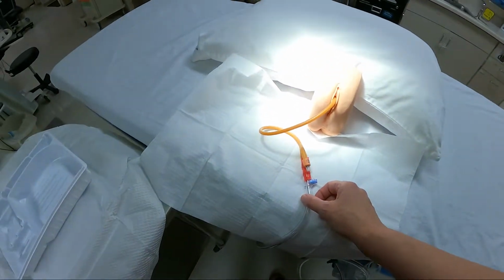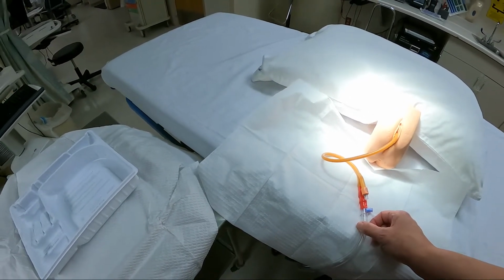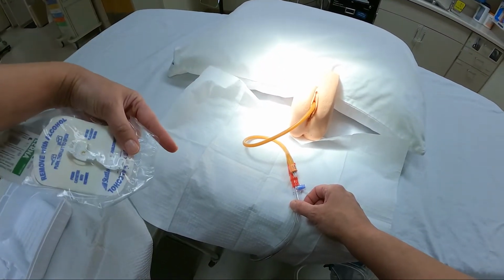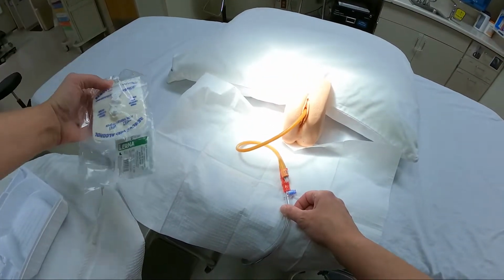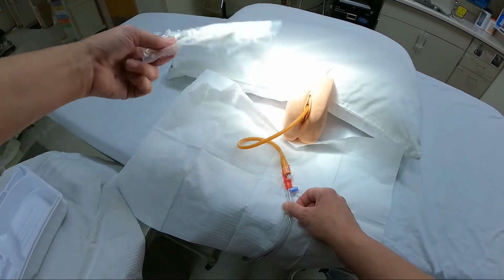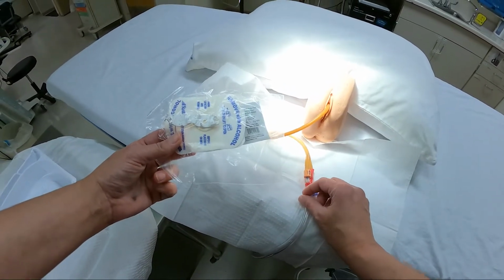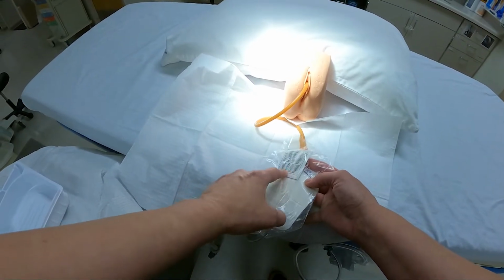And then another important part of all this is the stat lock. That's important because of moving the catheter up and down. Obviously everything outside of the bladder and down the urethra, everything past that is a source of infection. So it grows stuff, and if you shove it back up in there by moving the catheter, that's a problem. You also don't want it to become dislodged and the balloon get yanked out, because that can cause damage too, and blood clots.